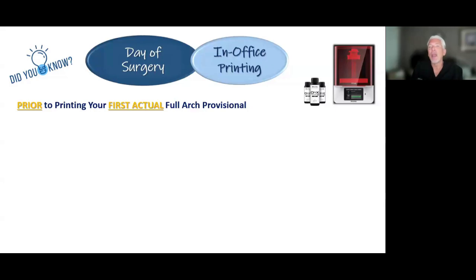If you have printing material that you haven't bought recently, and I'm not talking about expiration date, I'm talking about technology date. In the last year, some of the materials we were using 18 months ago worked, but they weren't quite there, either in strength or workability. Today, man, some of these materials are really great to work with. So that's a whole other thing to research, talk to your laboratory. We're going to help you be successful in your practice.